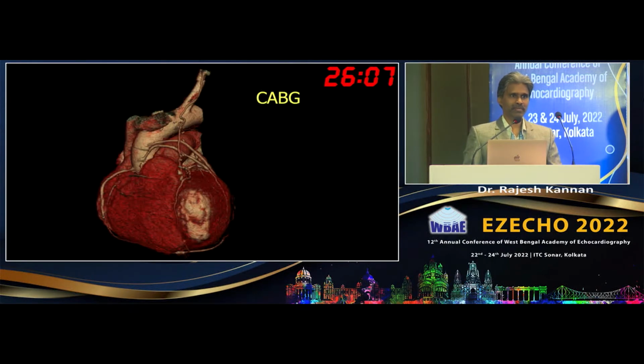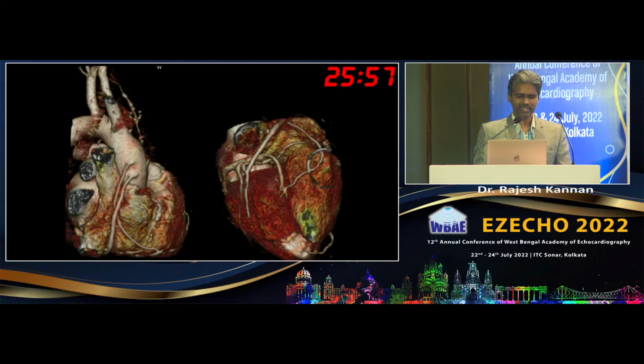Coming to the CABG, to assess the graft, CT angio is very good. Now looking at the different grafts, the LIMA graft and the SVG grafts. Here you can nicely show both the proximal anastomosis and the distal anastomosis, nicely patent grafts.